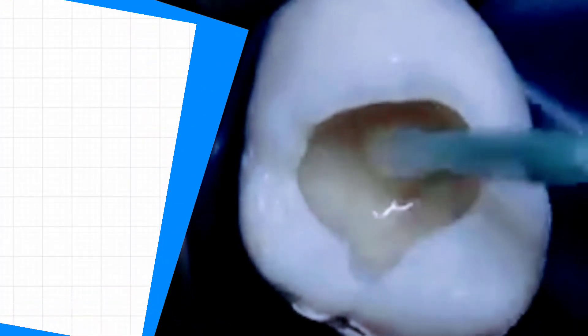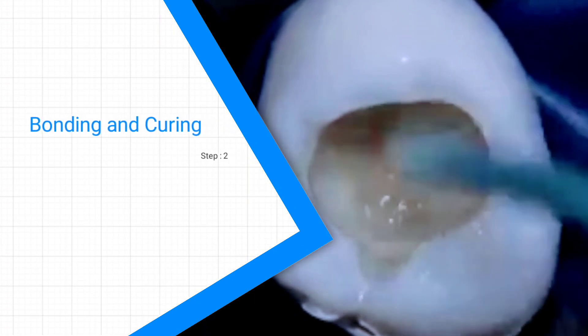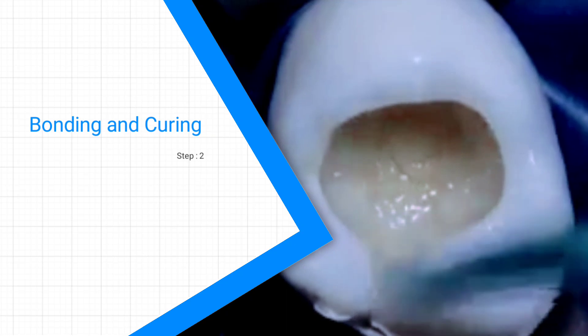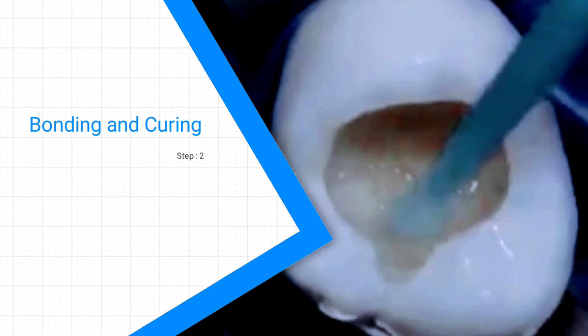With the applicator, dab a small amount of bonding agent on the etched surface, and then blow some air over the bonding agent to ensure that the layer is thin and even.